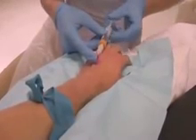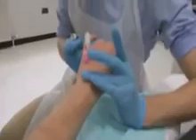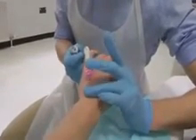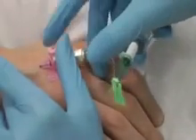Aspirate the blood slowly. Release the tourniquet. Holding the cannula securely again, occlude the vein. Raise the arm to ensure there is no blood loss. Attach the bionector and flush.